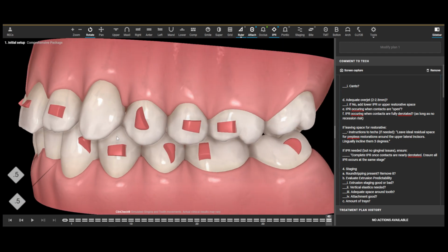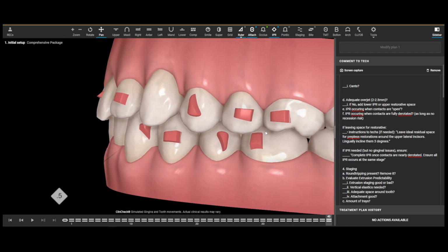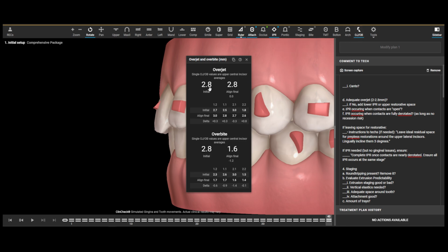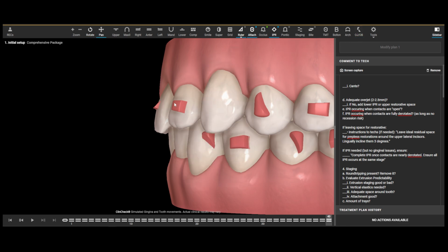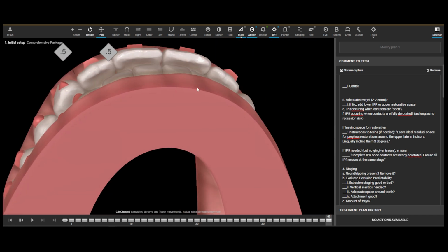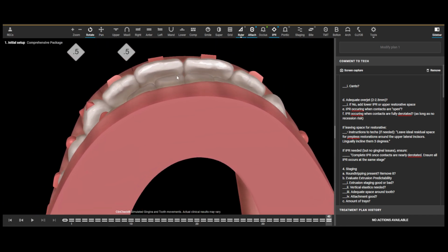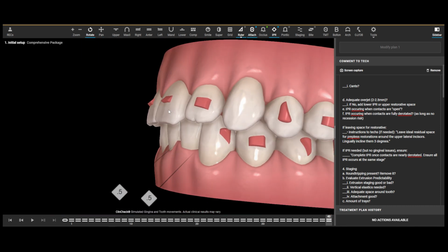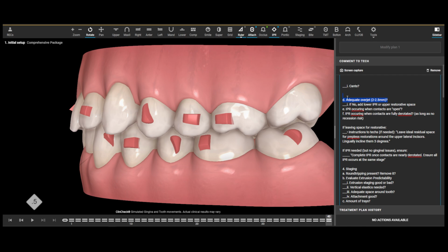Okay, is there enough overjet? So do you have 2 to 2.5 millimeters of overjet at the end of treatment? I don't, by the way, usually look at the table here, but you could. I usually just clinically look at it and say, does it look like there's enough overjet there? Or does it look like the anterior teeth are going to smash into each other? But yes, we do have enough overjet. So I'm happy.